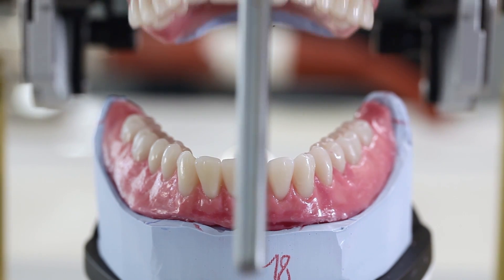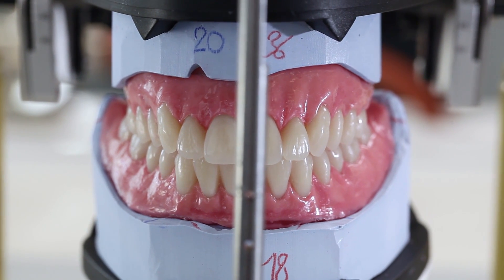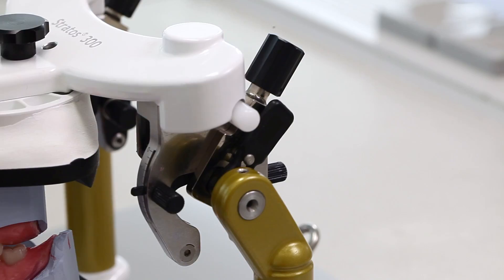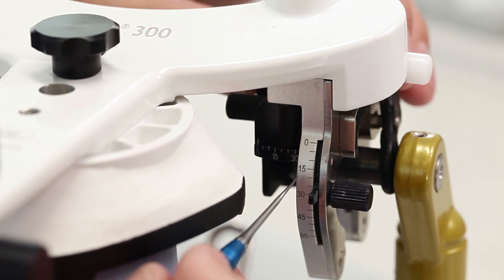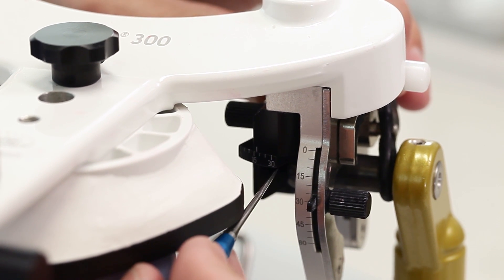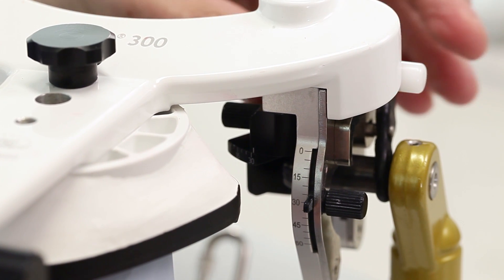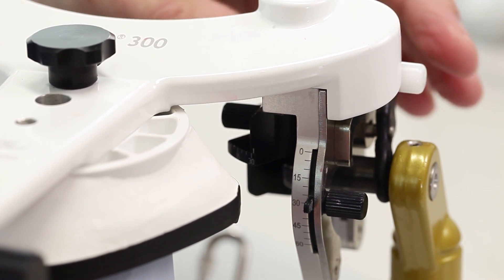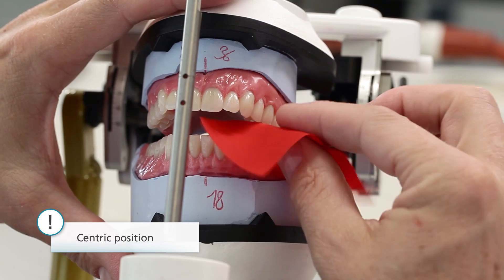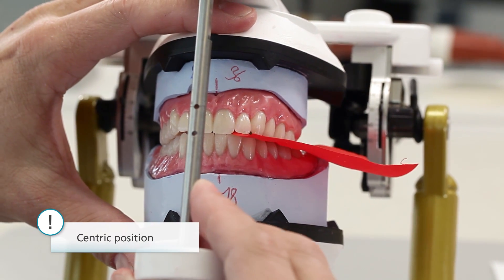As soon as the dentures have been completed in wax, check their occlusal function. Open the centric lock, the bennet angle and the immediate side shift movement in the articulator. The protrusion angle should remain secured at 30 degrees according to average values. Check the occlusal functions starting from the centric position.